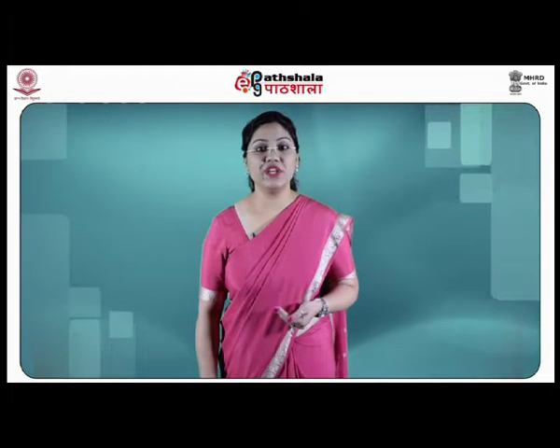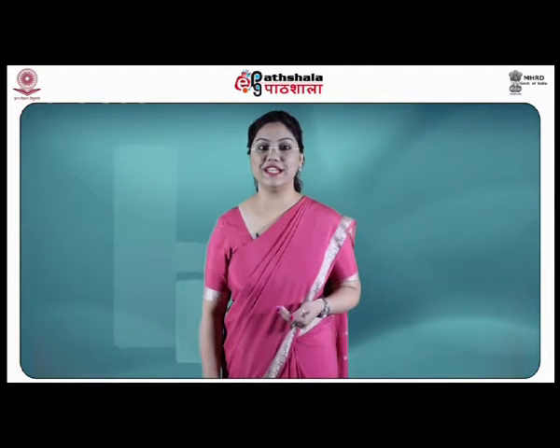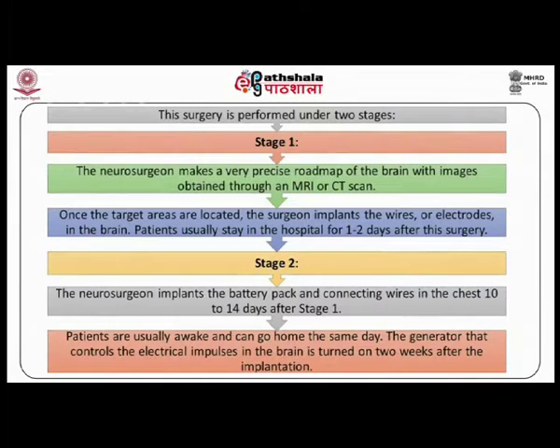During deep brain stimulation surgery, the patient is awake under light sedation. It allows the neurosurgeon to monitor electrical activity in the brain during the procedure and to test other relevant conditions. This surgery is performed under two stages.